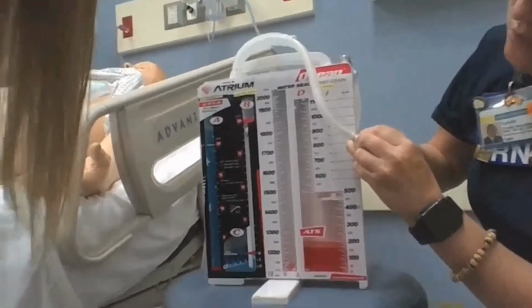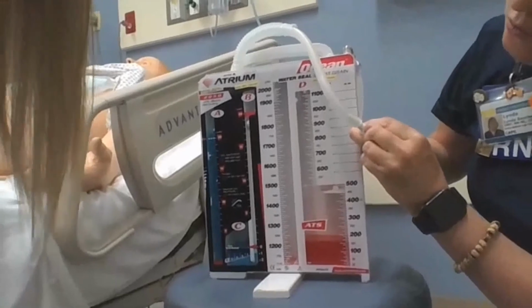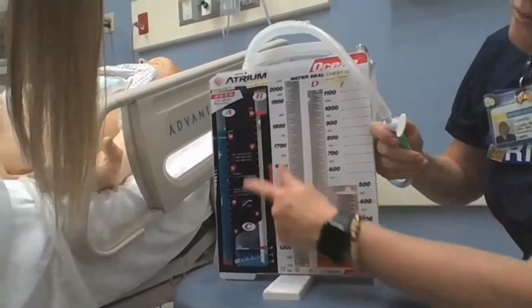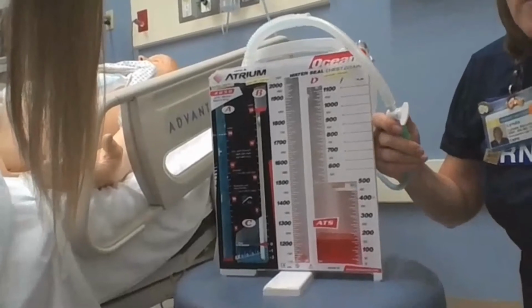Okay, so one of the questions you're going to get asked is, which do you think is pulling more fluid from my patient? Right now, with this amount of bubbling, or now with this much bubbling?